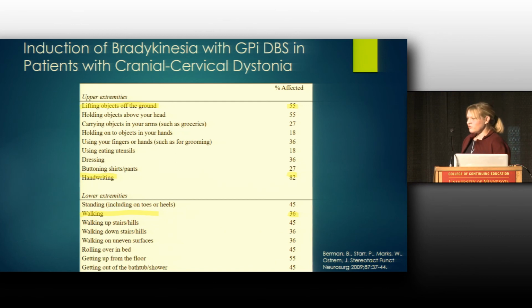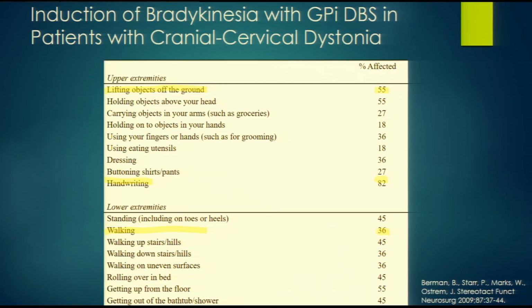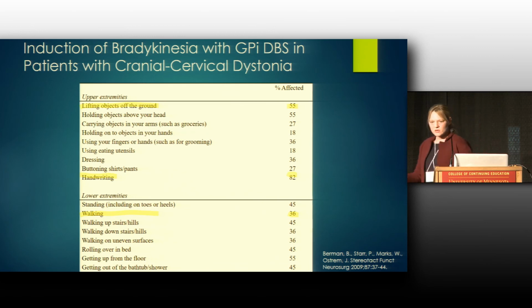One issue we found is when you modulate the motor system of the brain, you might notice effects in other areas potentially. Now, there has been no effect shown on cognition looking longer term, 1 year, 3 years, when you follow with neuropsychological testing. But a group at UCSF noted that in these patients who had formerly normal working arms and limbs who underwent deep brain stimulation in the globus pallidus interna, they started to notice these subtle things.